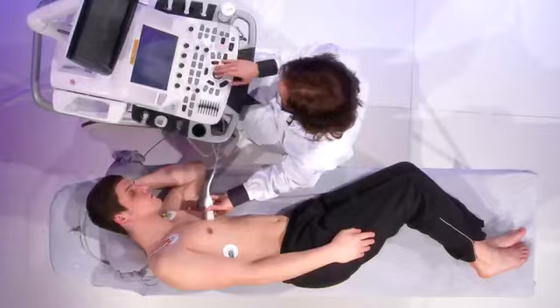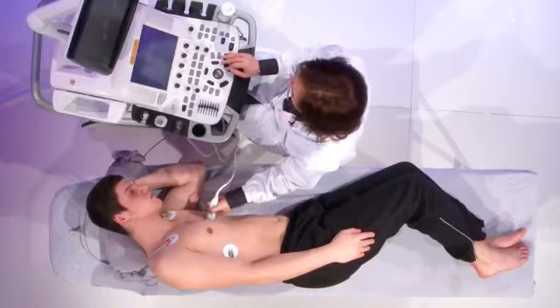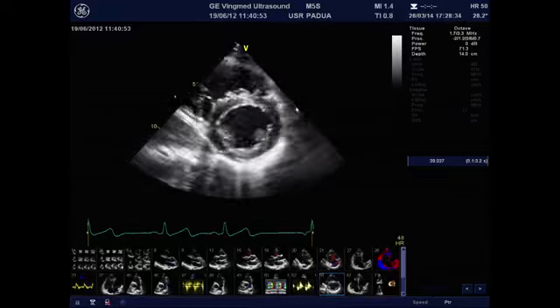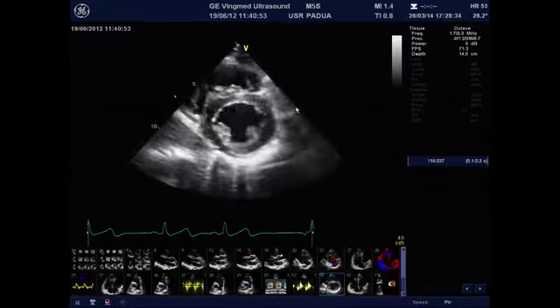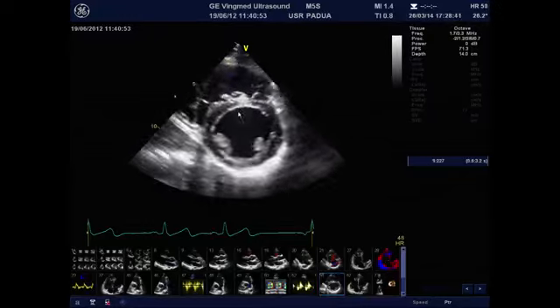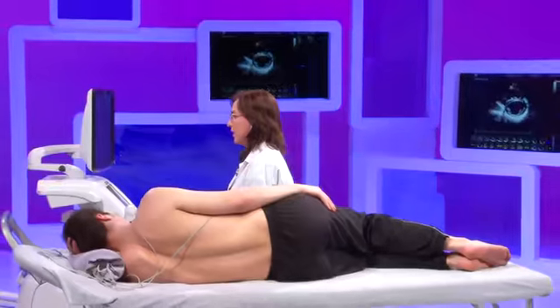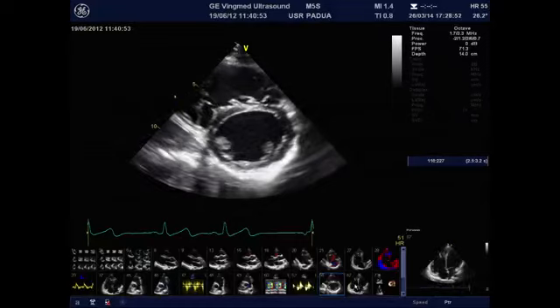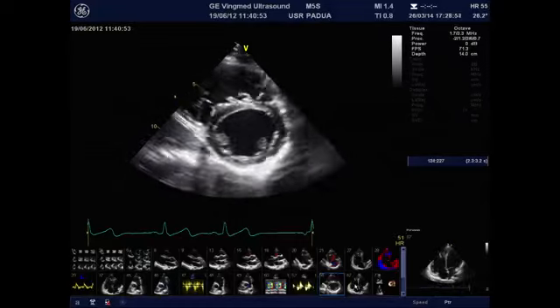Now let's take a close look at the right chambers and at the consequences of this volume overload on the right heart. If I see from this position the short axis view, I can appreciate the motion of the septum and the septal flattening in diastole, which is indicative of the volume overload, and also of the interdependence that is related to the high pressure in the right ventricle, which impacts on the septum and produces a diastolic dysfunction on the left side.